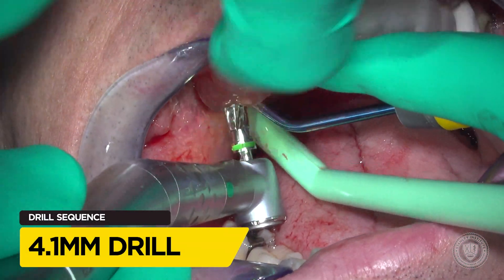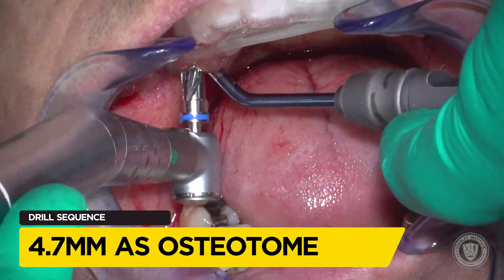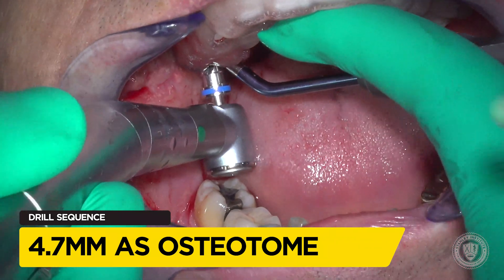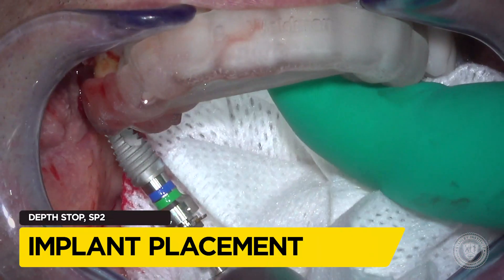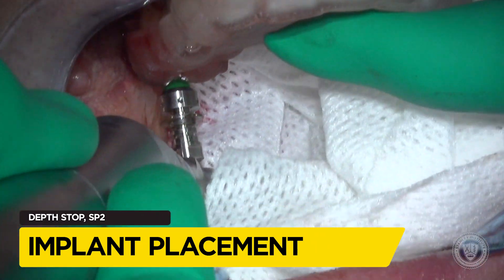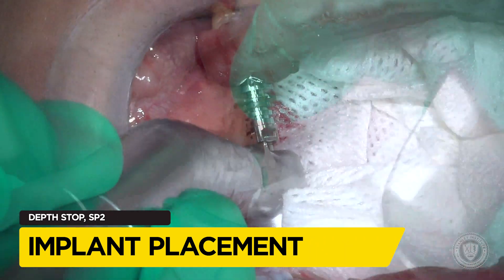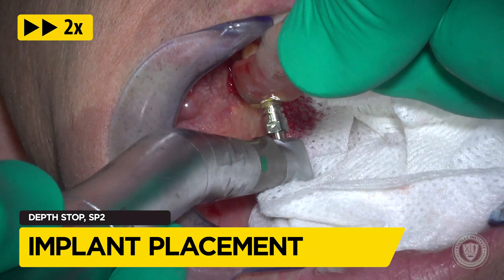Now we're in the posterior maxilla, and we all know the posterior maxilla has pretty soft bone. Watch what happens with the 4-7 drill — we don't even spin it and it goes to depth, so we're using it as an osteotome. We undersized the osteotomy and go for immediate implant placement with a 5.8mm diameter implant. The snap link will let us know when we're down to the proper depth.